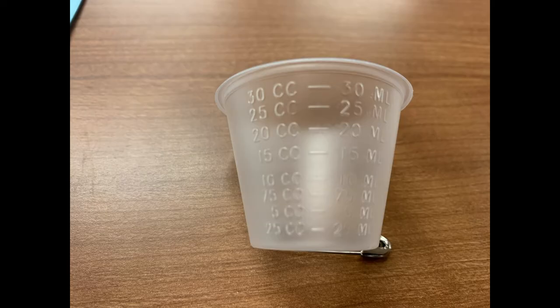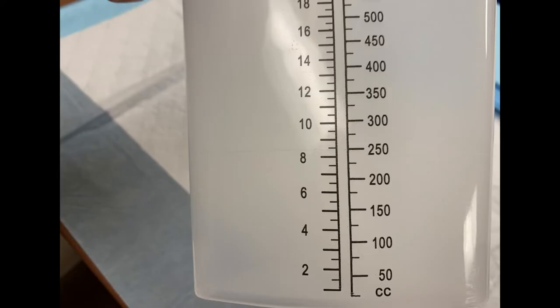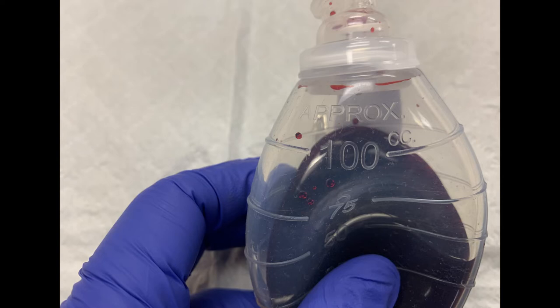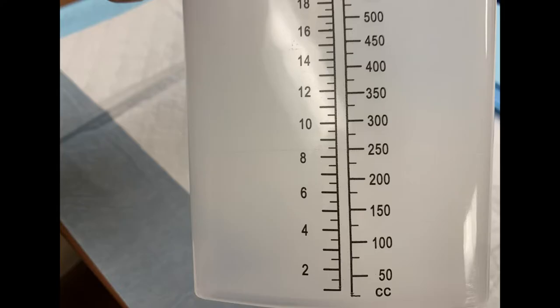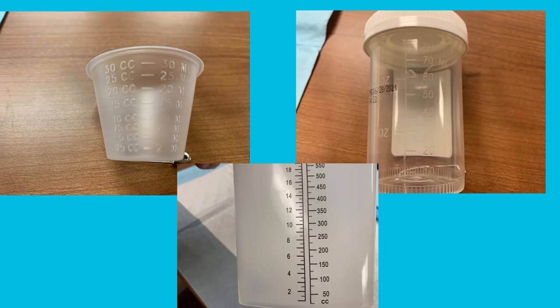Small plastic med cups can hold and measure with varying increments up to 30 cc's of output, giving the most accurate measurement for smaller volumes. A specimen collection cup can hold and measure in increments of 10 cc's up to 80 cc's of fluid. A graduated cylinder can hold up to 1000 cc's but only in increments of 50 cc's, so it will not give accurate measurement at typical JP drain volumes. Choose the appropriate container for the amount of output you are dealing with.